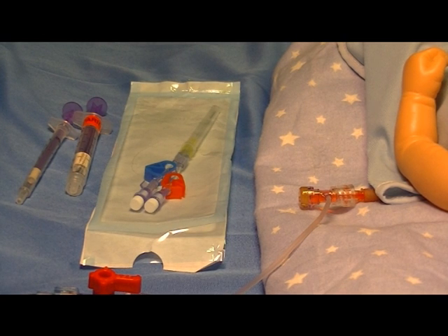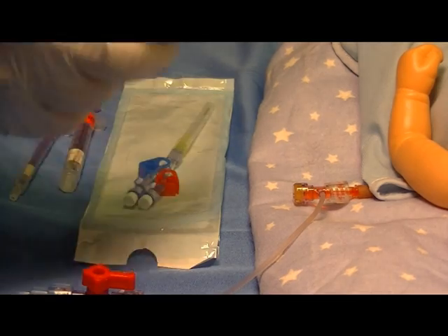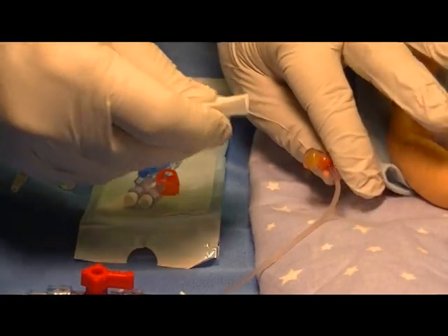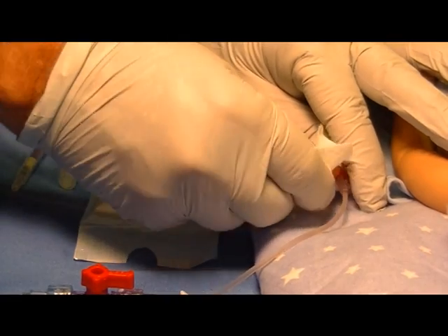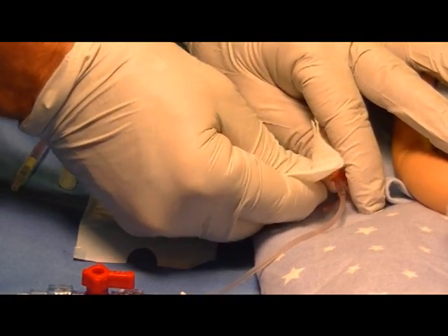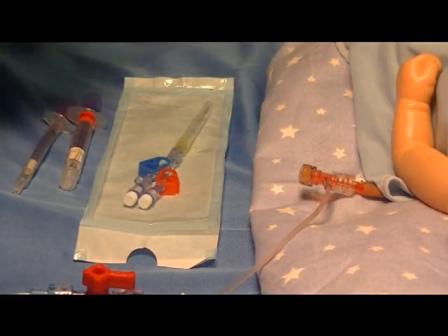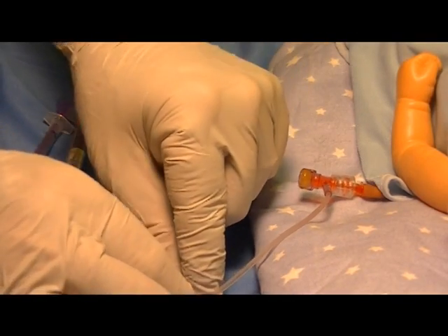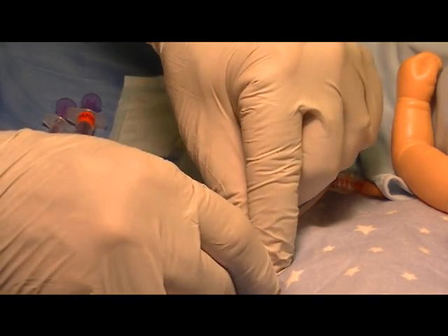The first step is to prep the T-connector according to your hospital's policy and then clamp the T-connector to prevent flow from the line.